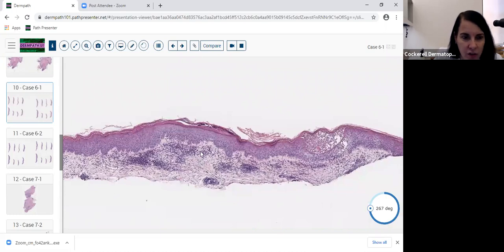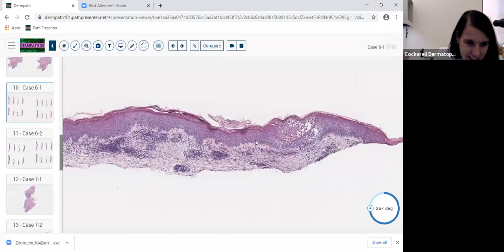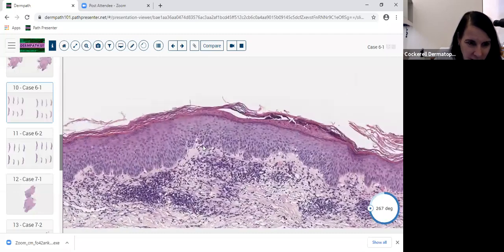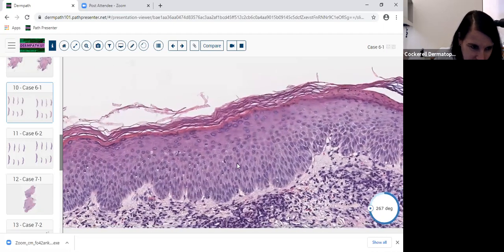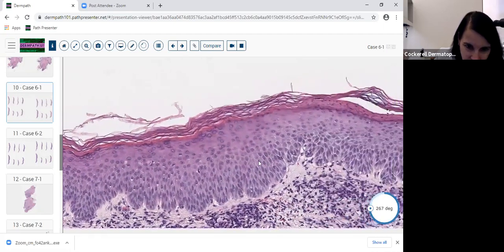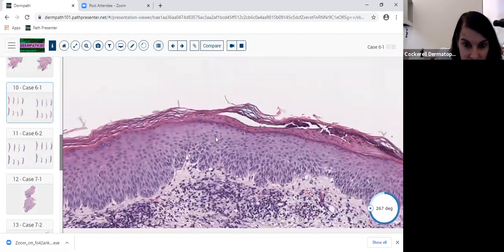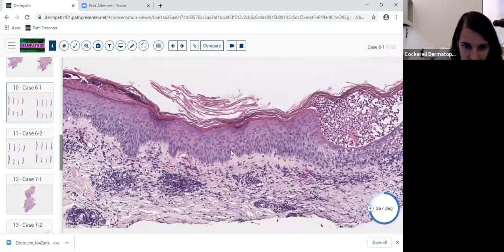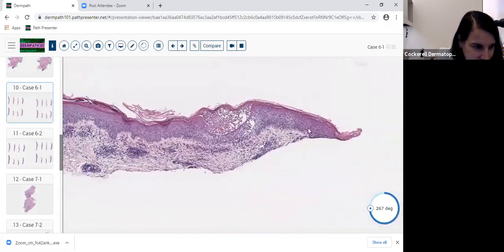Be sure to look in your stratum corneum for tinea, because they love to show you stuff like this and get you calling it pustular psoriasis, Sneddon-Wilkinson, and all this stuff. But you better look very carefully in that stratum corneum. And if they show it on the boards, they'll show it with a lot of organisms, because they're only going to show it to you on H&E. I think there are organisms in here, but this wasn't enough for me to put on a board exam. It was difficult because we needed the stain.